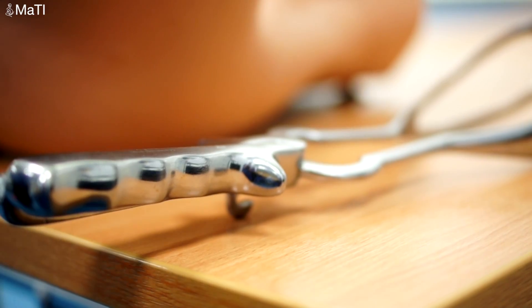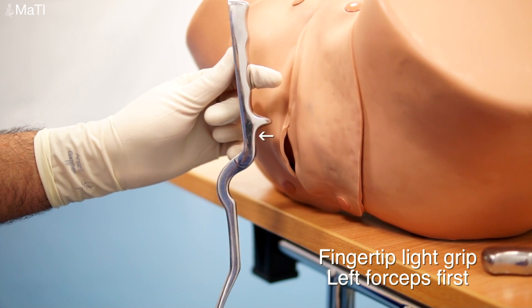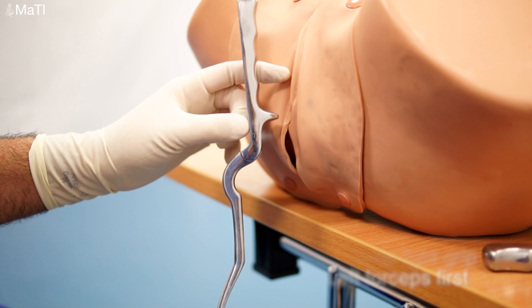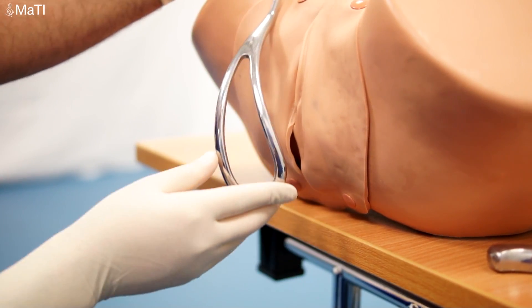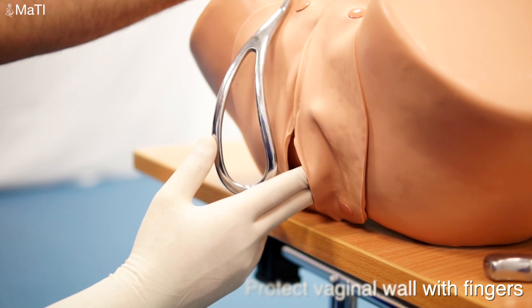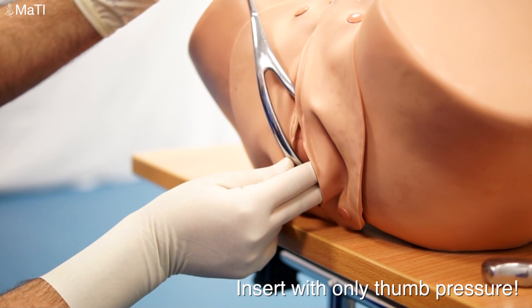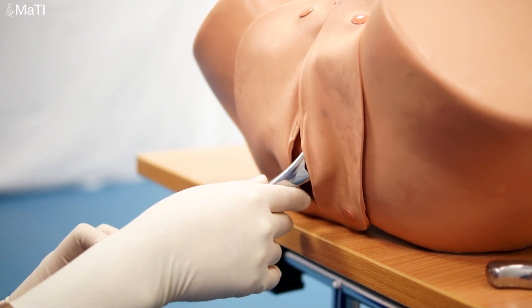I'll now demonstrate how to perform a forceps delivery with the long-traction forceps. Firstly, hold the left forcep blade with a fingertip touch — a very light grip — and using the right hand, protect the vaginal wall, and using just my thumb, exerting very little pressure, placing the forceps correctly. They'll often hold themselves in place.